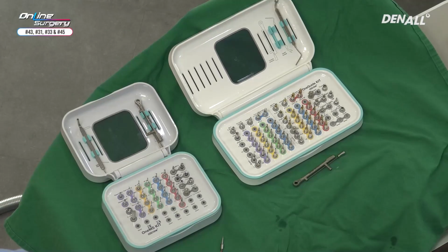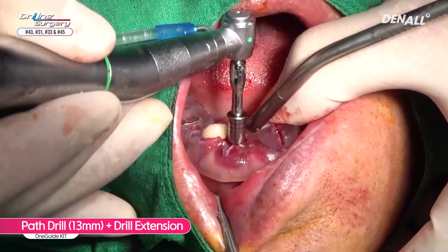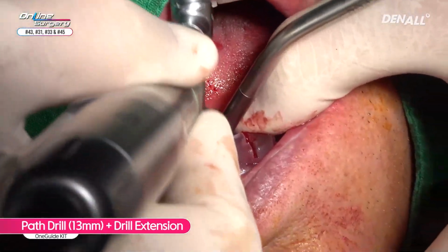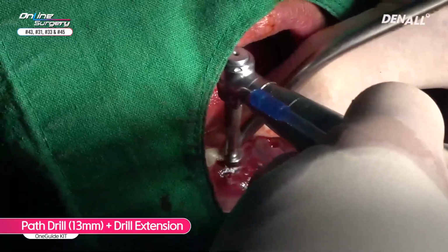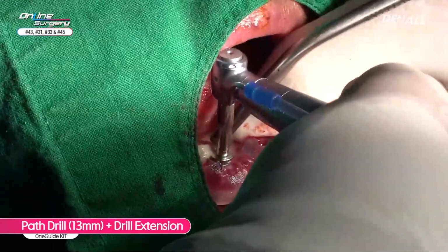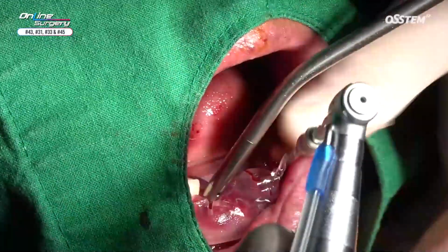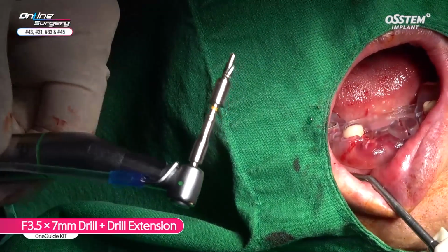Because of the handpiece, it does not go in fully. Because it is extraction socket, 7 millimeter is going to be done first.